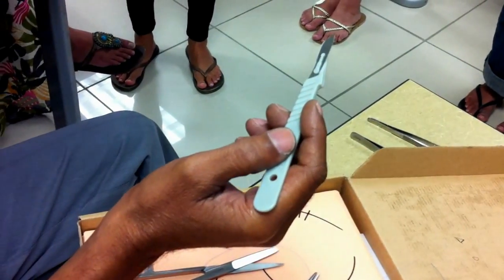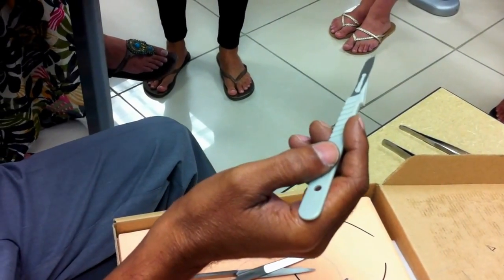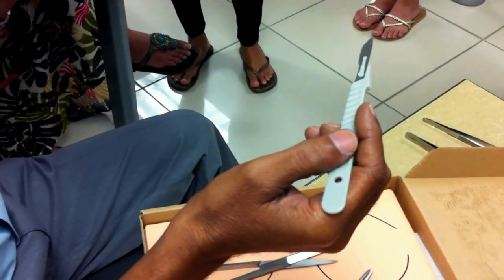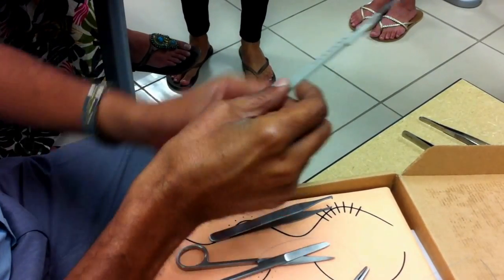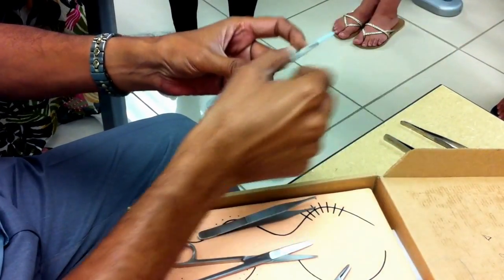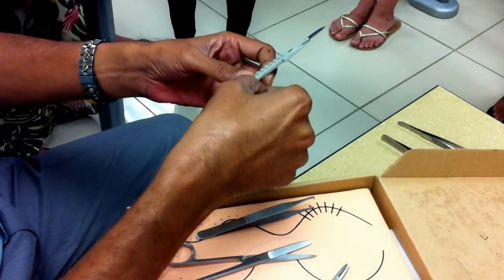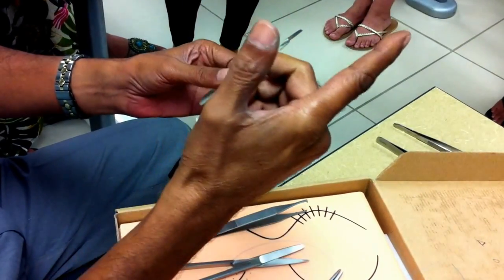The 11 one is slightly smaller. The 12 one is curved like that for opening abscesses. That's why it is also referred to as a bisturi blade. So this is size 10. After you have used it, you can remove it and dispose of it, and the handle can be sterilized and we can put another blade on it. So this is the handle which is recycled; the blades are disposed of.